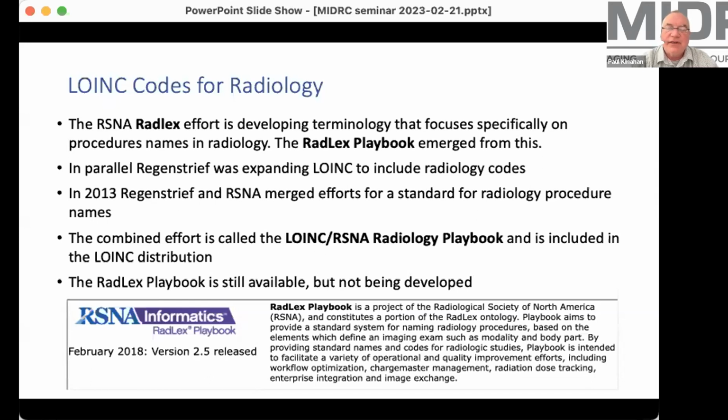We'll talk in more detail about something called the RADLEX. I talked about the RADLEX effort. The RADLEX group also went a step further and developed something they called the RADLEX Playbook, which I'll talk a bit more about. This was really a set of study descriptions in a structured manner, with a whole bunch of secondary information such as presence or absence of contrast, timing information, things like that. And this was being developed by the RSNA informatics group, as I mentioned.